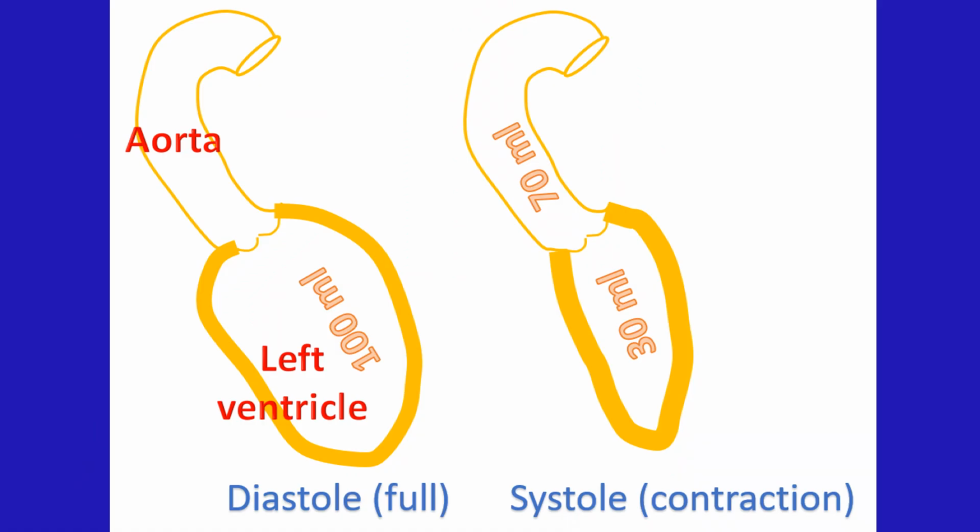When it comes to function of the heart, the concentration is often on the left ventricle, which pumps blood to the whole body. An important value in the report is the ejection fraction. Ejection fraction is the fraction of the blood from the full left ventricle which is ejected out during each contraction. Suppose after filling, when the left ventricle relaxes in diastole, it has 100 ml of blood. If 70 ml is pumped out by the next contraction or systole, the ejection fraction will be 70%.